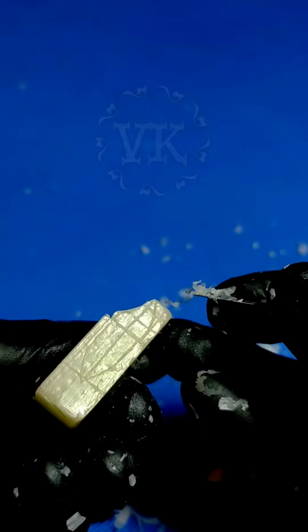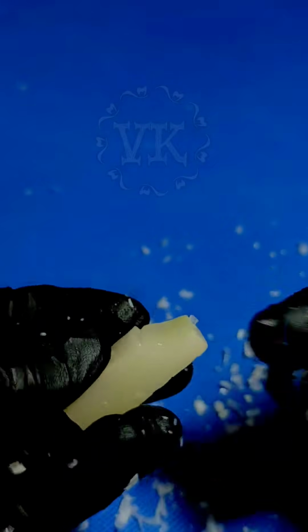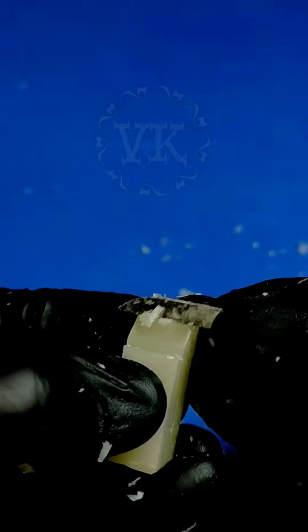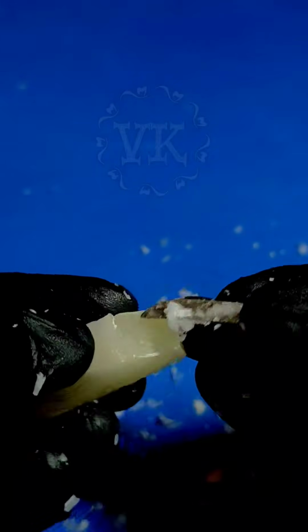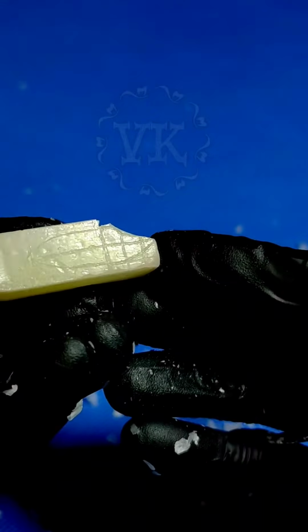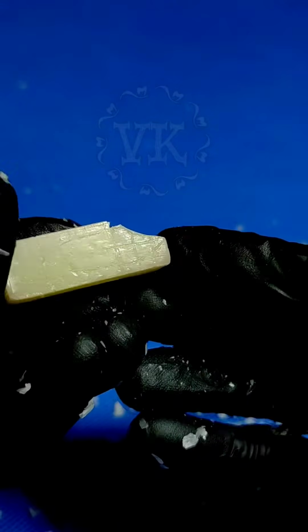Since we are not taking exact measurements, we need to perfectly cut all the wax outside the outline. You should not leave any wax that is present outside the outline that you are making. Okay, that's the outline.